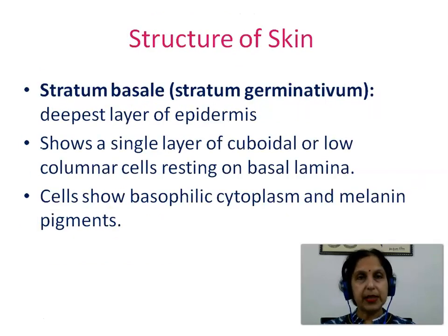Stratum basale, also known as Stratum germinativum, the deepest layer of epidermis, shows a single layer of cuboidal or low columnar cells resting on the basal lamina. Cells show basophilic cytoplasm and melanin pigments.